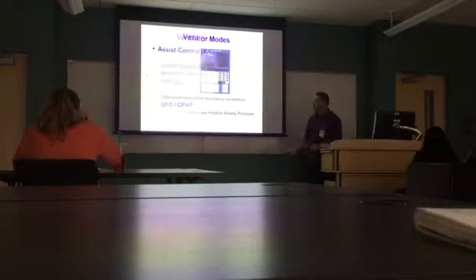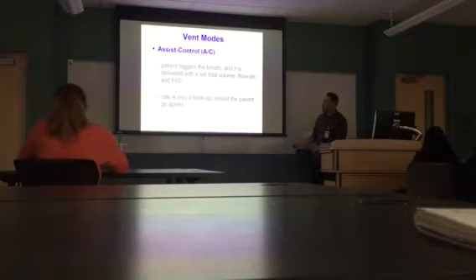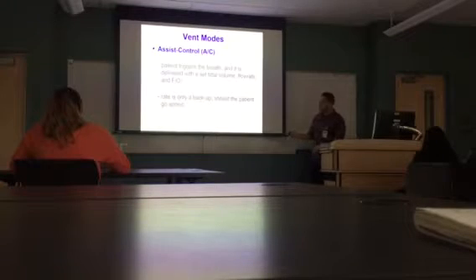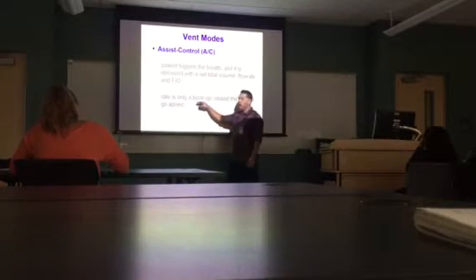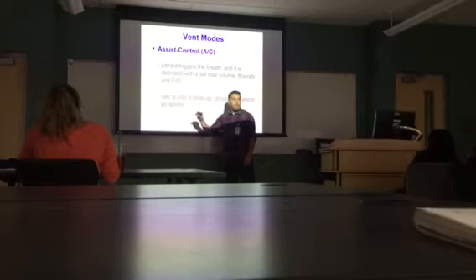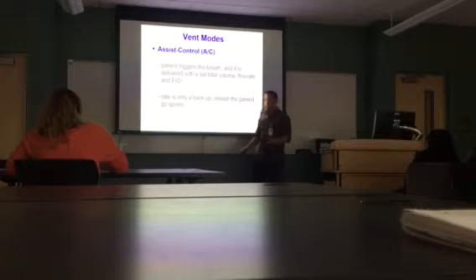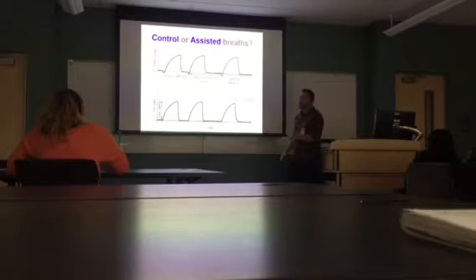So those are your 3 top modes there. This is just showing you assist control, okay? So just telling you that the rate is only as a backup, right? So I dialed in a rate of 10, but if the patient wants to get 20, he gets 20. Okay, so it's only as a backup. If he stops breathing, he's getting his backup of 10.